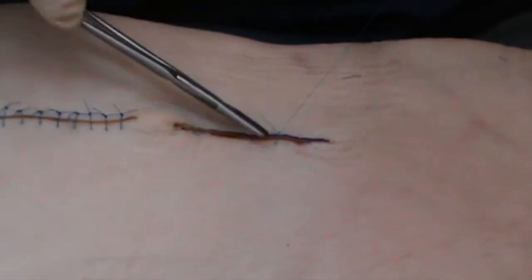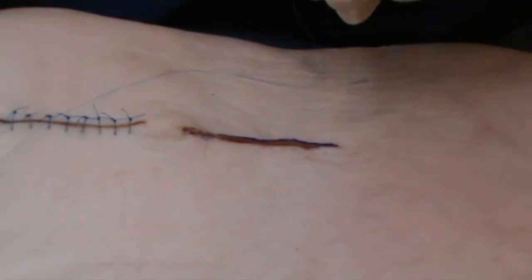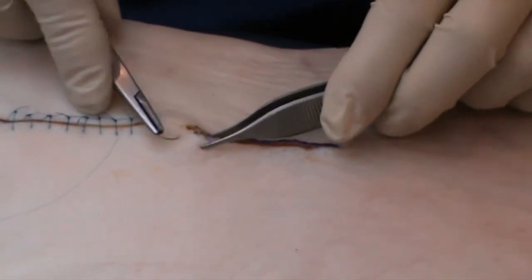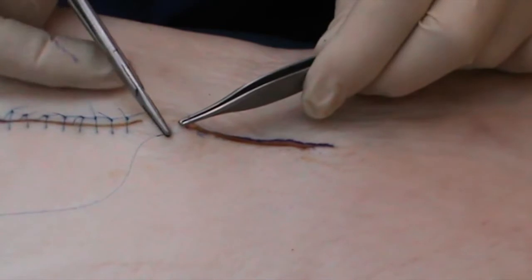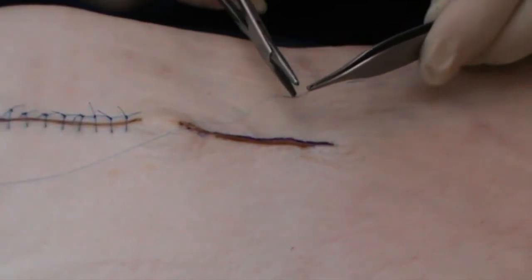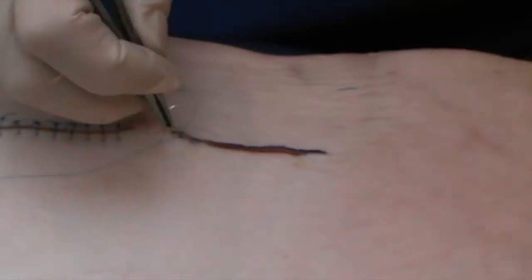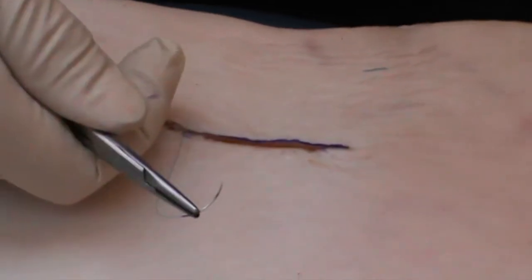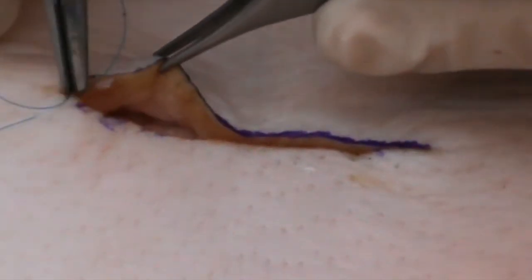And it would be closed like that. Alternatively, what I might wish to do is to close this with a continuous subcuticular closure. Here I could start just away from one apex, getting the wound so that the suture comes out just below the epidermis. And here I will be closing the wound, holding the suture holders like this — a completely different way to the standard way of holding it — because here I'm trying to close by running the suture along parallel to the skin.